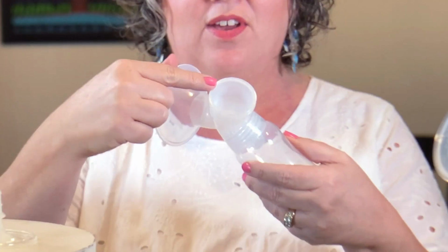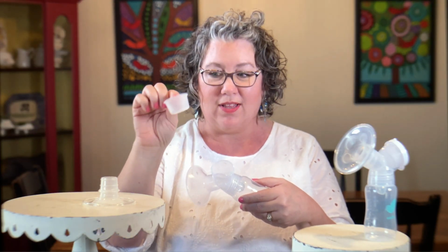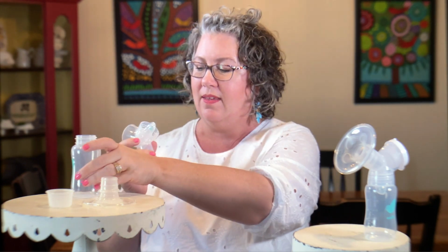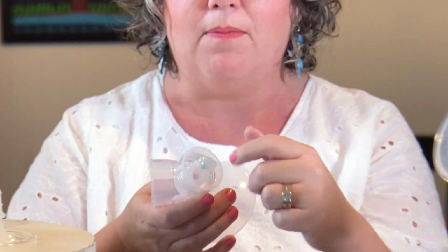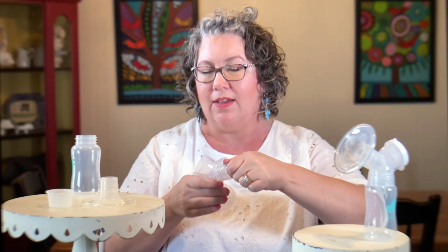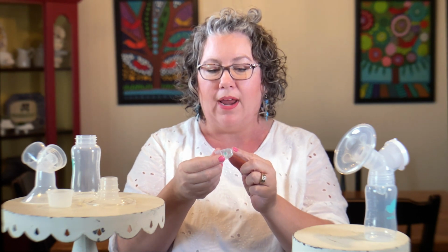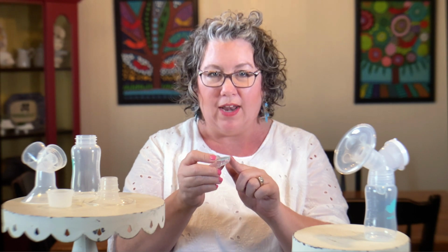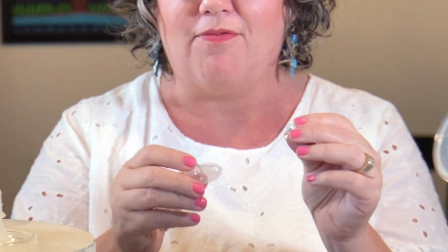All right, so where we took the cap off, we have the diaphragm. We will clean this part. Now we can unscrew the bottle. And then if you look on the inside of your flange, you're going to find the valve and the membrane. Grasp that and give it a little twist and pull it off. The membrane is the little green piece that fits on the valve. You need to go ahead and pull that off also. So just grab it with your thumb and finger and snap it off.